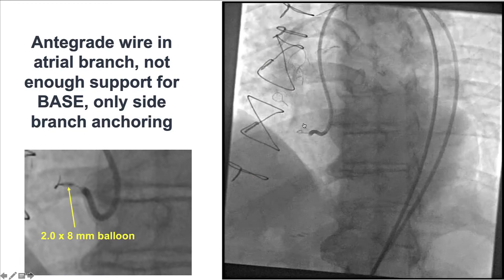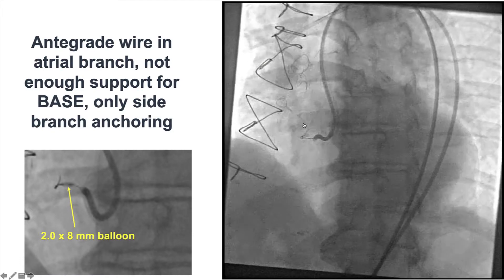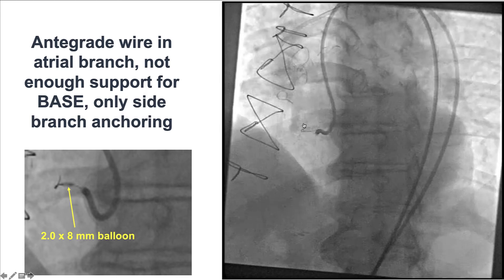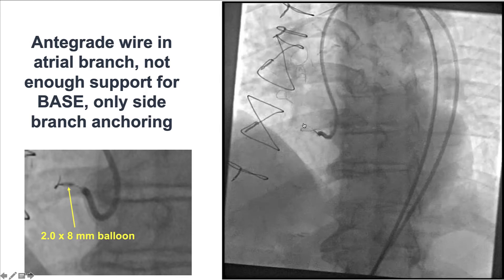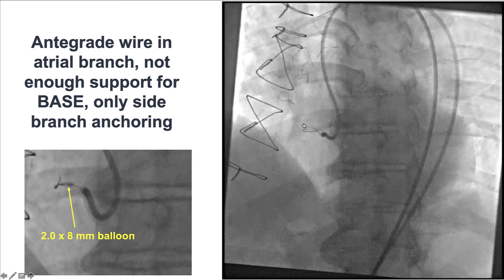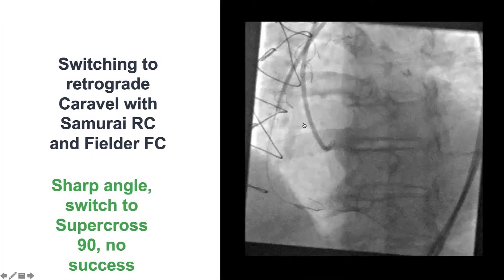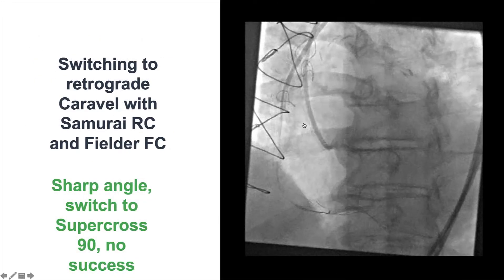We initially tried briefly with antegrade crossing; however, we were unable to cross. The wire kept entering into the small branch, and therefore we decided to switch to the retrograde approach.